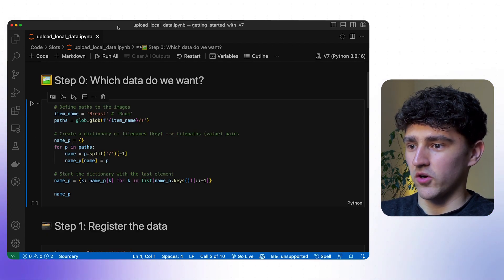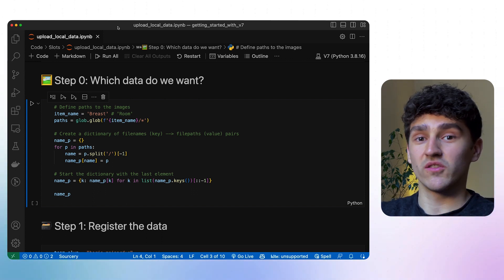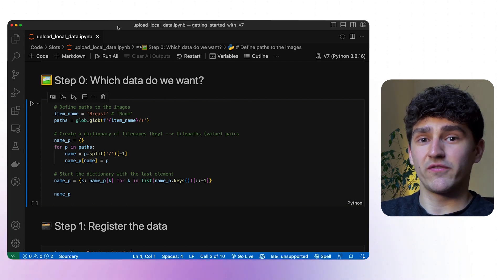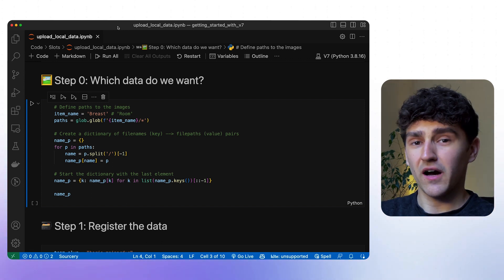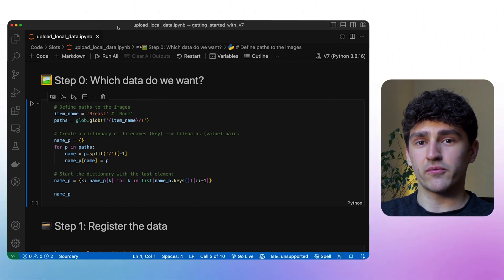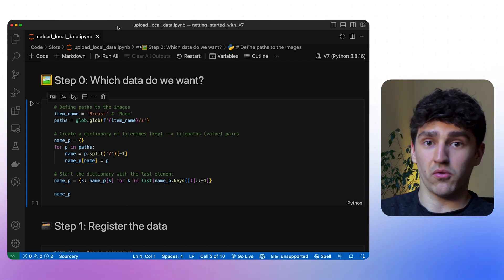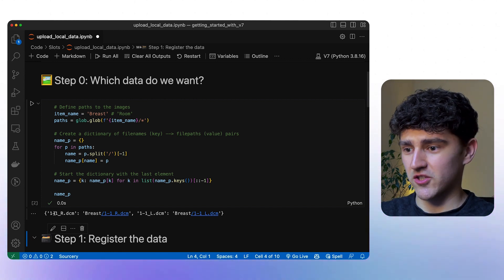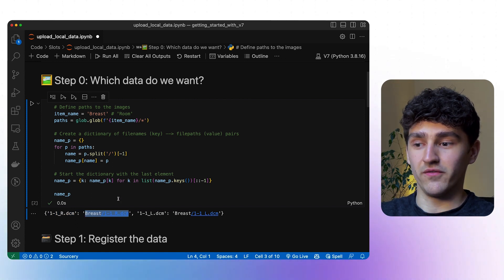Now, step 0: which images do we actually want to upload? In this example, I have an extra directory called BREAST where I have two DICOM images — one for the left breast and one for the right breast. After getting those two images, I store them in a dictionary with the item name as the key and the respective file path as the value. When running the cell, we can see exactly that.